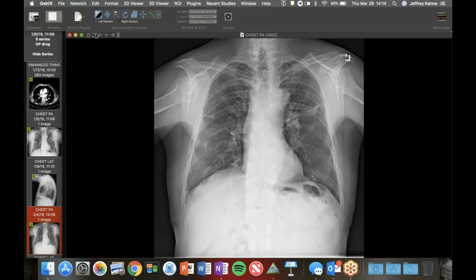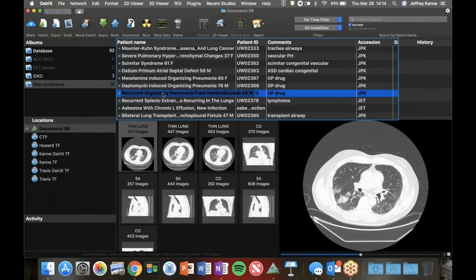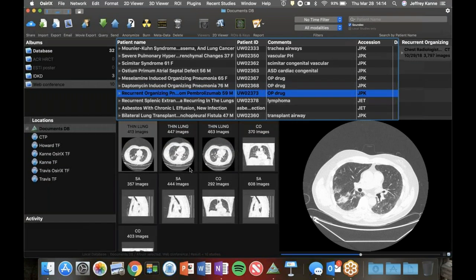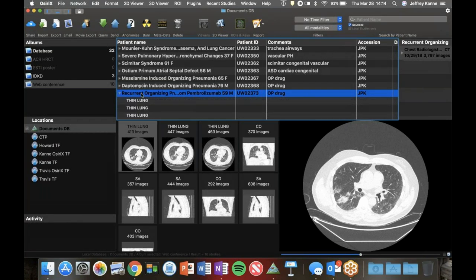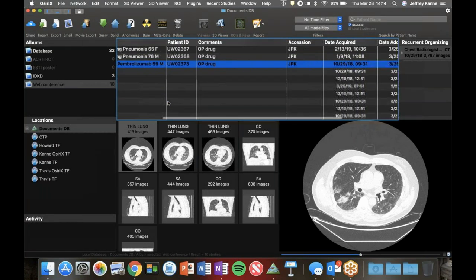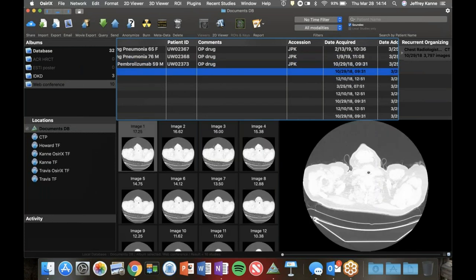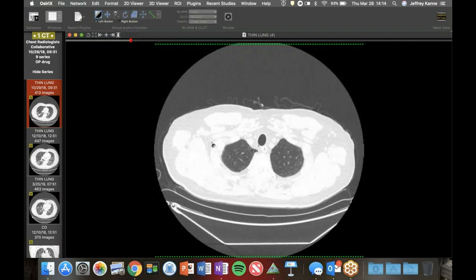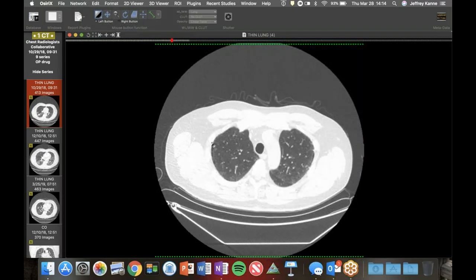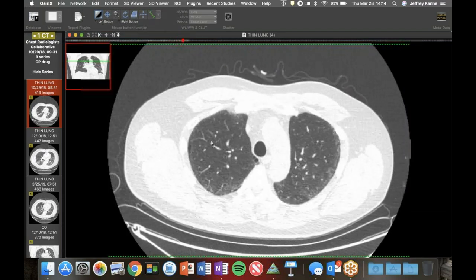So not everything is an infection. The third case - this patient was on pembrolizumab, which is often used to treat many cancers, but particularly we've seen it in a lot of squamous cell cancers. The first scan was at time zero. This was done for surveillance - the patient was a former smoker with some emphysema. They developed peripheral ground glass opacity and nodular band-like areas of consolidation.